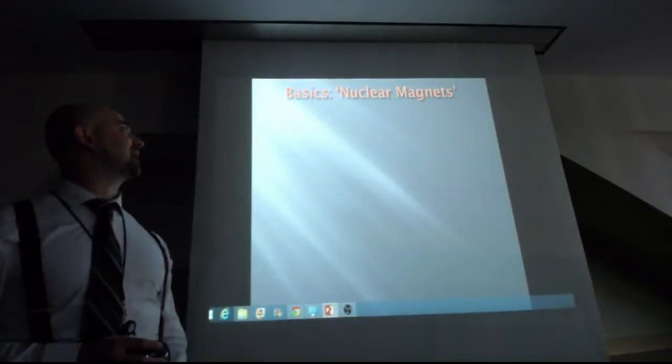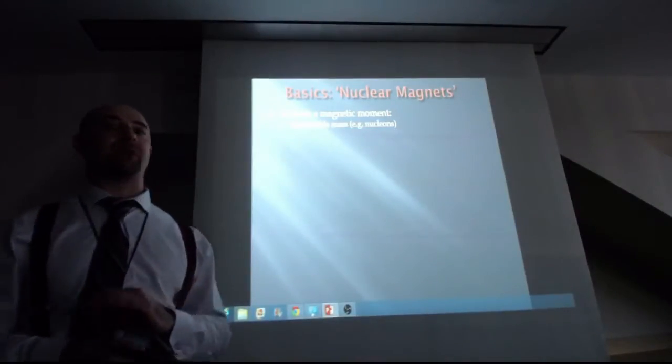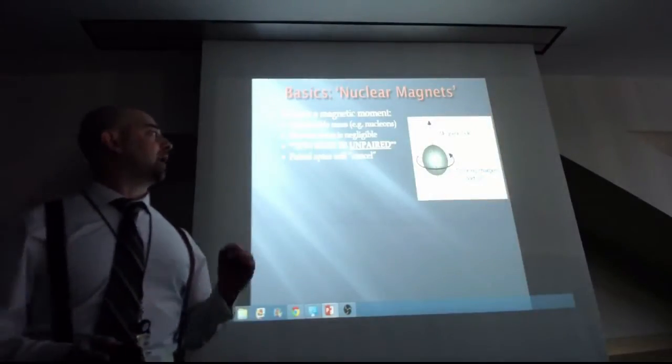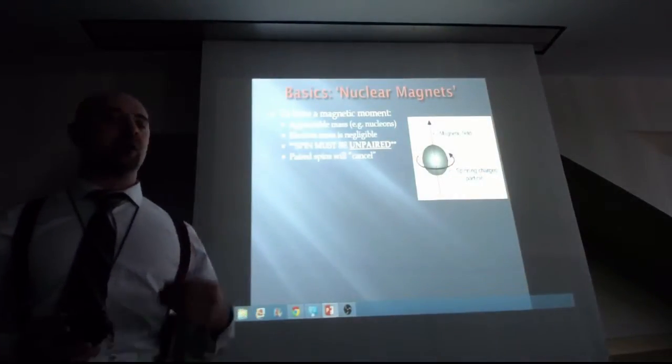Nuclear dipole moments. All right, so now let's talk about what it takes to have a magnet. If you are a nucleus, there's a few things to consider, whether or not you have an appreciable mass.